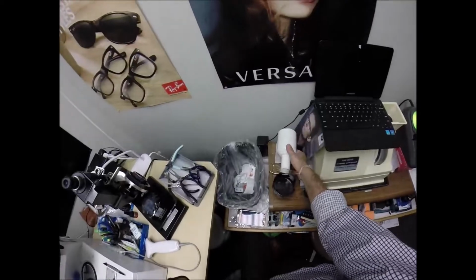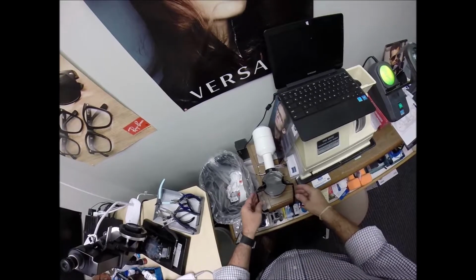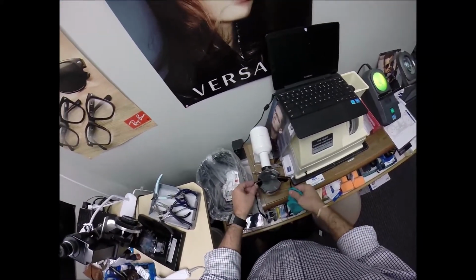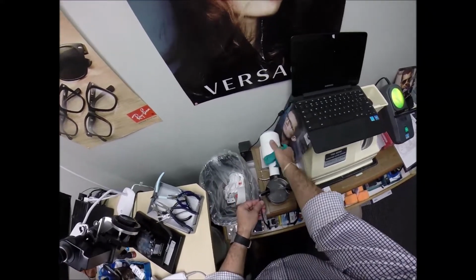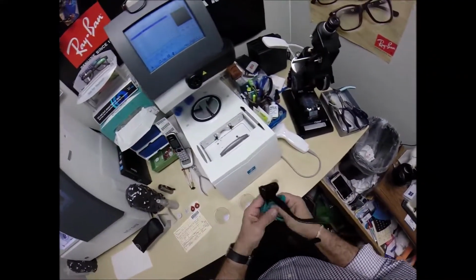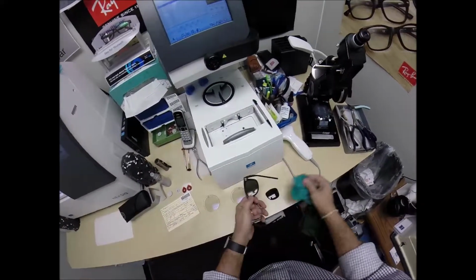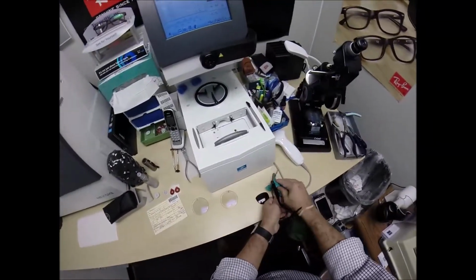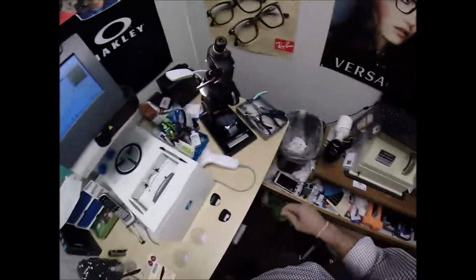But first, I got to take out the original glass lenses, which can be a bit of an issue. So I need to use some heat. I'm going to put these in here. Heat up the frame. I'm actually going to get a cleaning cloth ready because the lenses are going to be so hot after I take it out of here. Let's see if it'll work first time around. Try and pop the original glass lenses out. There we go. There's that one. Let me take out the other one. There we go.